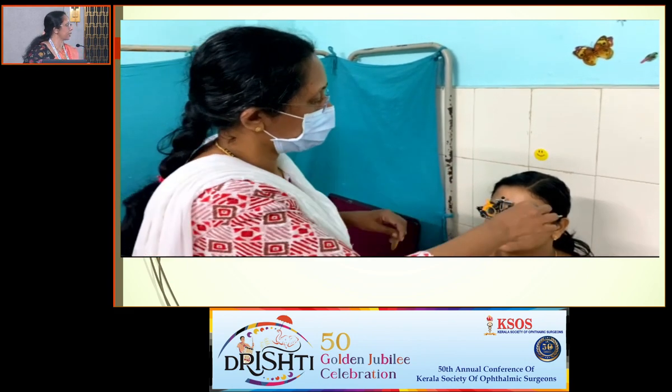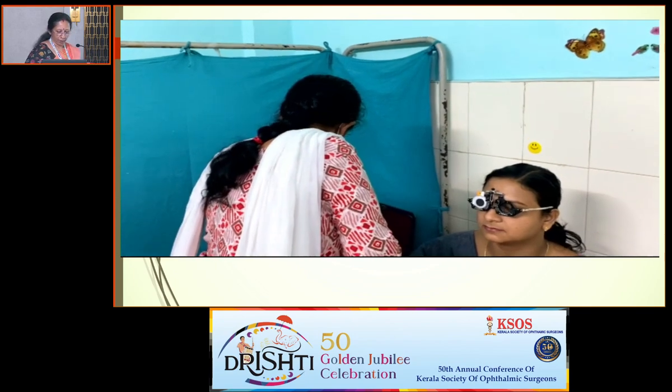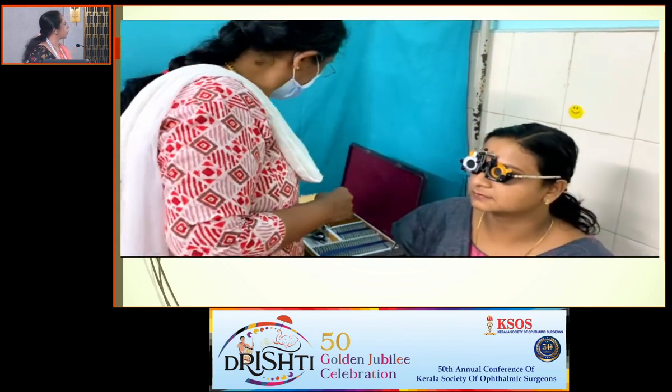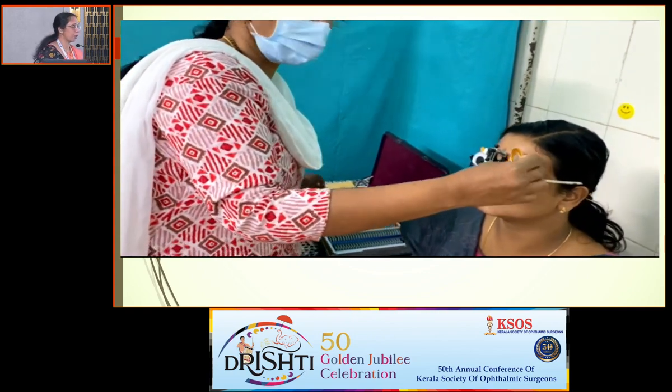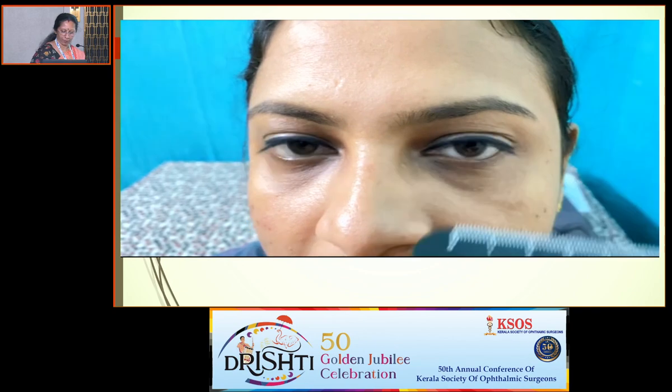The trial lens has to be tried, and see whether the patient is comfortable uniocularly, binocularly, and also whether the patient is comfortable for near work. This is the subjective refraction being done with the patient.